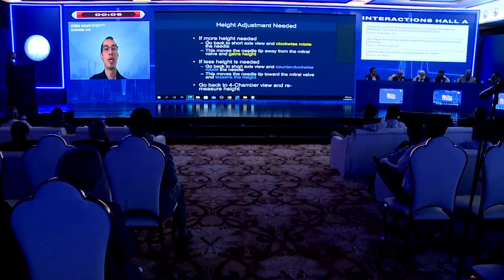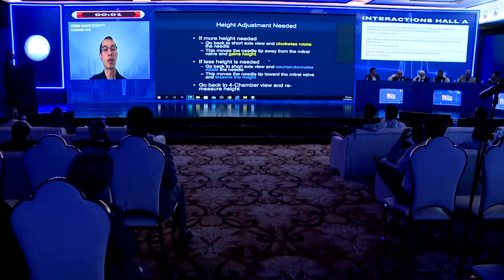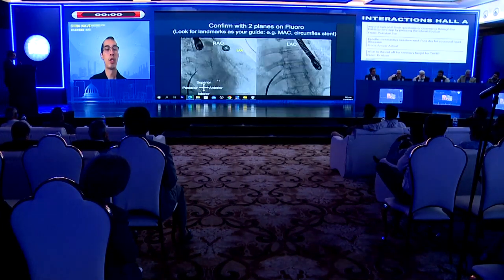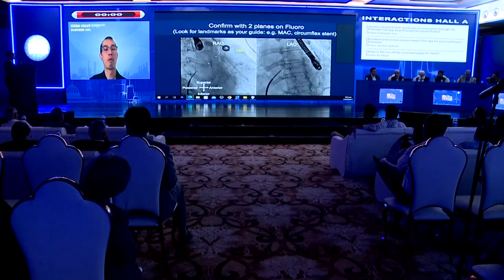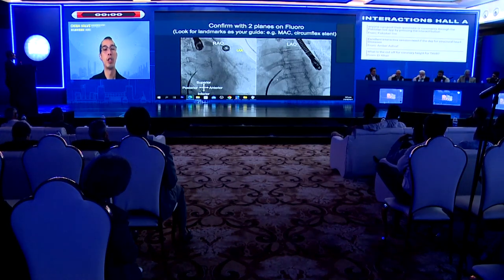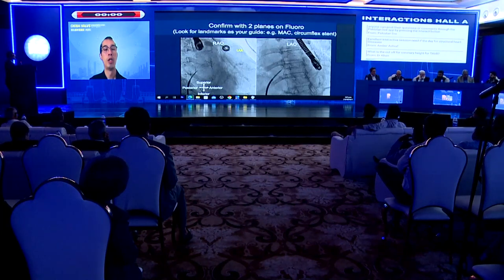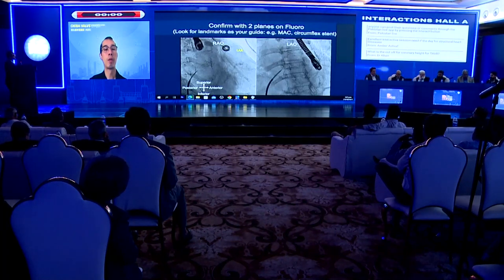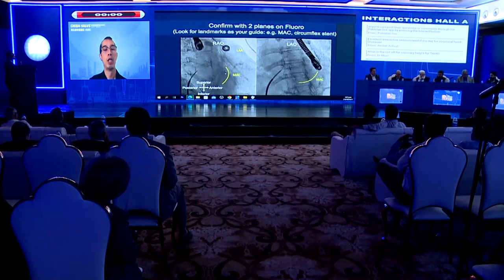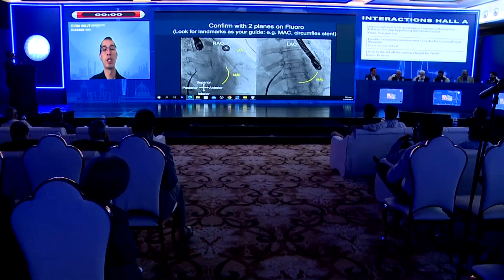The clock-to-gain-height and counter-clock-to-lose-height principle is reiterated. Once the septum is crossed, wire access should be secured in the pulmonary vein or left atrial appendage. On RAO projection, the superior, inferior, posterior, and anterior orientations are confirmed. In one example, mitral valve anatomy is visible along with evidence of MAC.